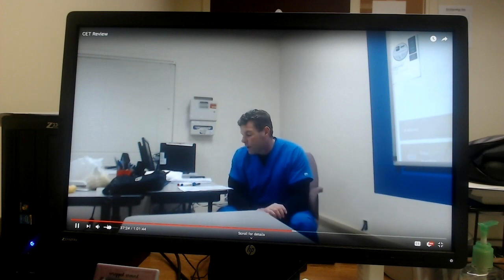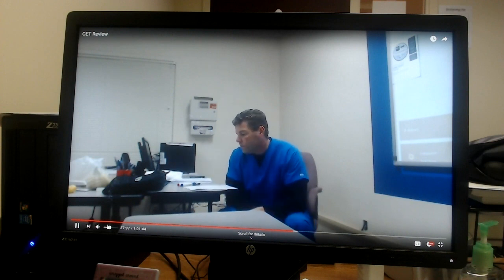60, right. The technician is performing an EKG on a patient who has a permanent pacemaker. Which of the following indicates that the pacemaker is firing but failing to capture? C, the pacemaker spikes are not followed by complexes. Good.